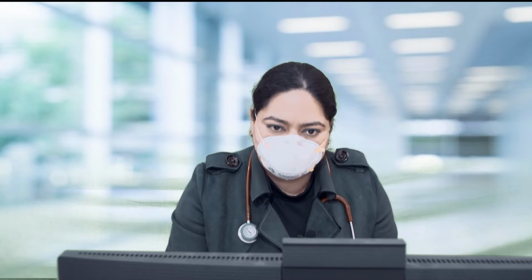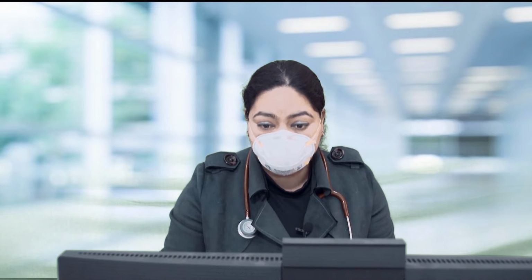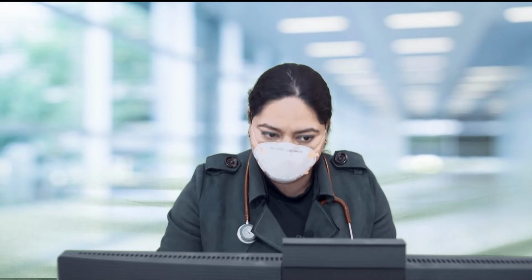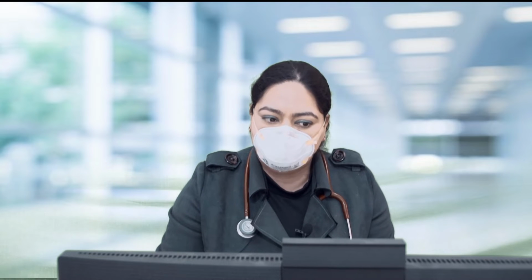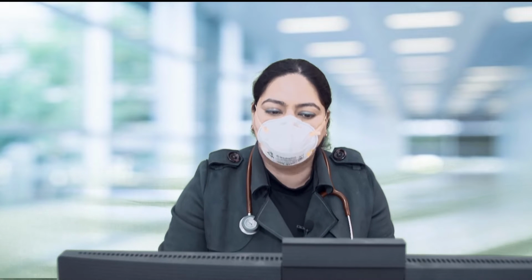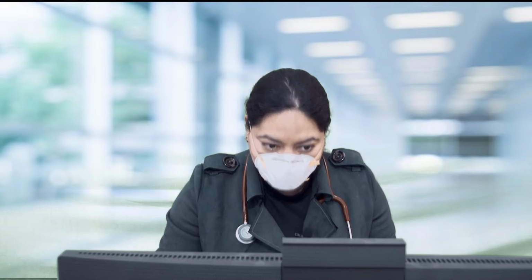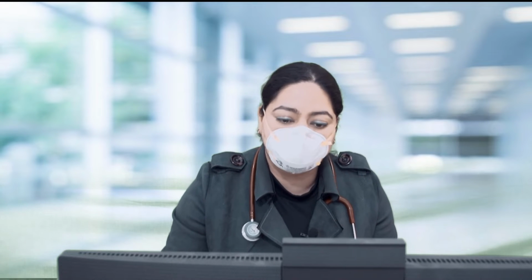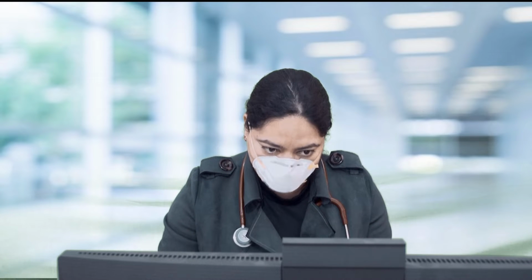So when do we start a BIPAP? Typical indications for BIPAP are when the pH is below 7.35 and the PCO2 that we assess on ABG is more than 45 mm of mercury, and the respiratory rate of the patient is more than 20 to 24 breaths per minute despite standard medical therapy. It remains the preferred choice for patients with COPD who develop acute respiratory acidosis during hospital admission.